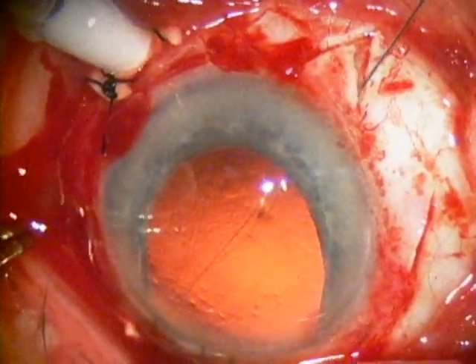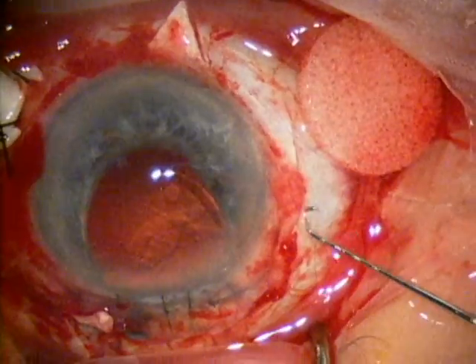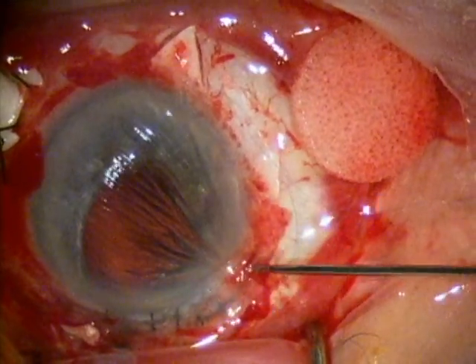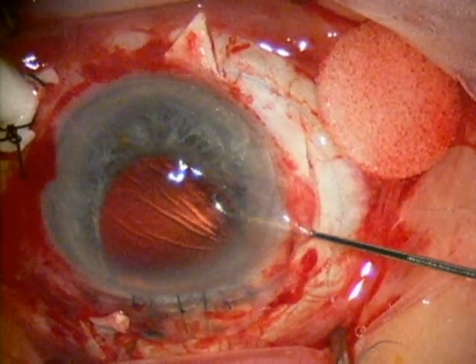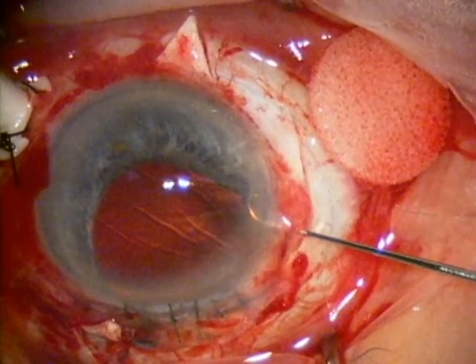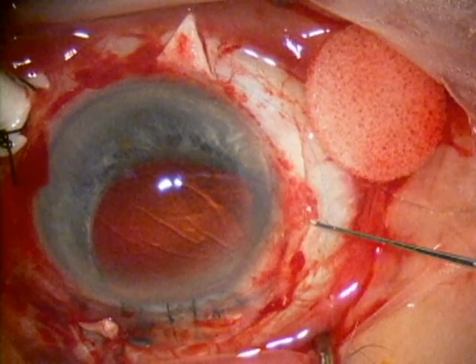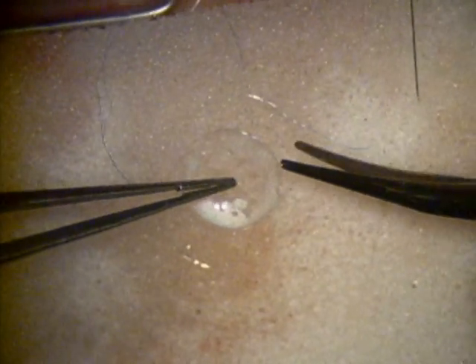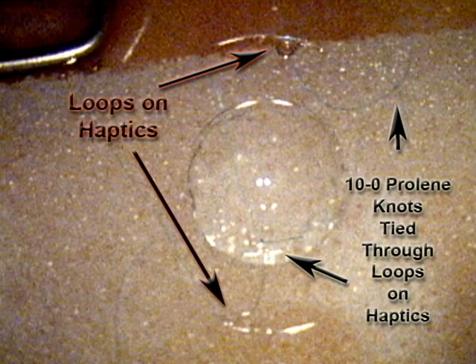It's important these needles be placed just behind the iris. The two suture passes have been made and now the suture inside the eye is pulled out through the incision where the lens will be inserted later. You'll see that this prolene suture is now tied around the intraocular lens and that's what will be used to support the lens inside of the eye.